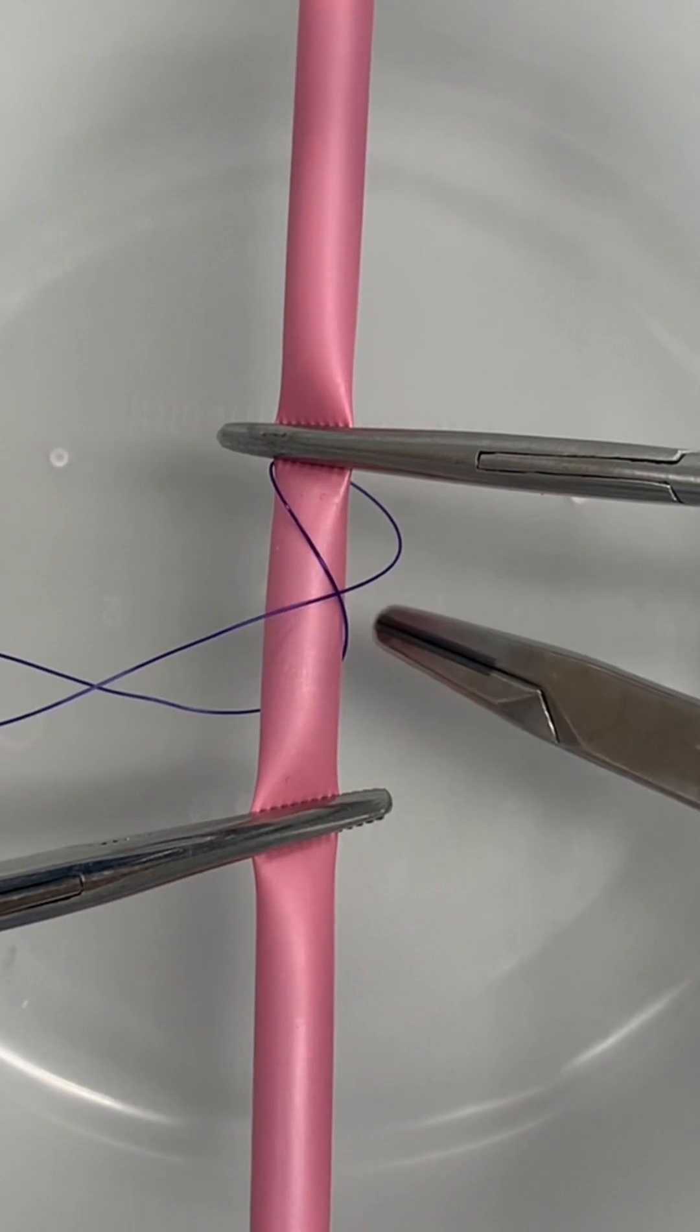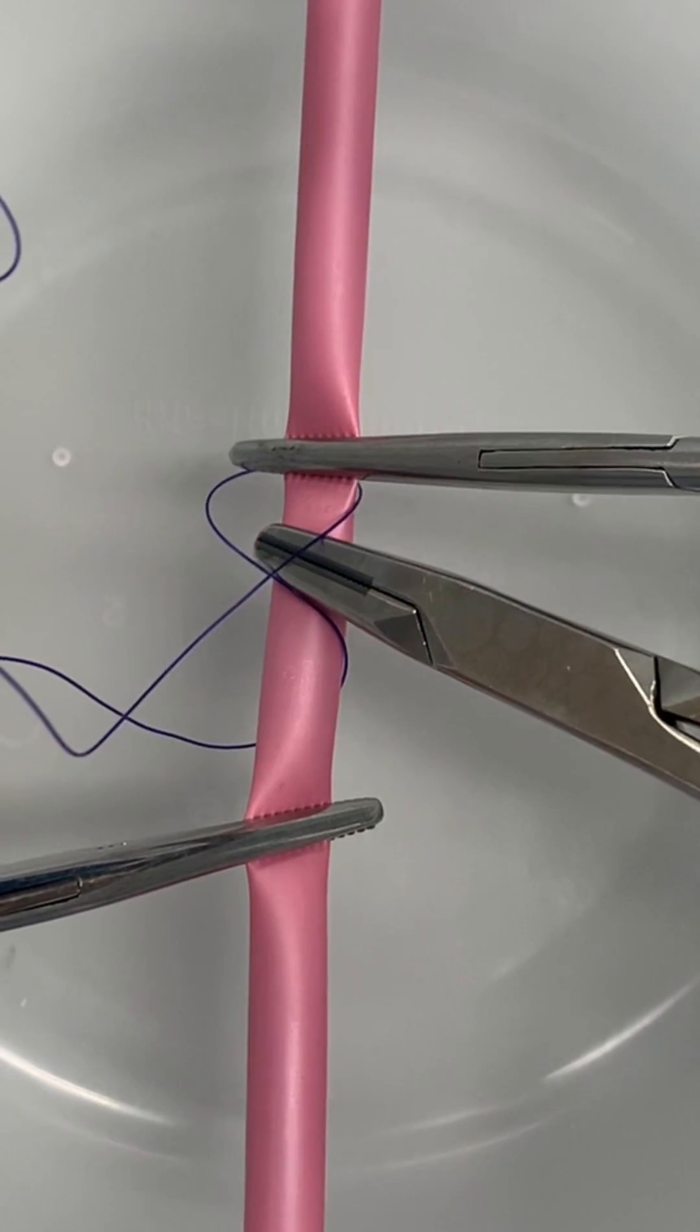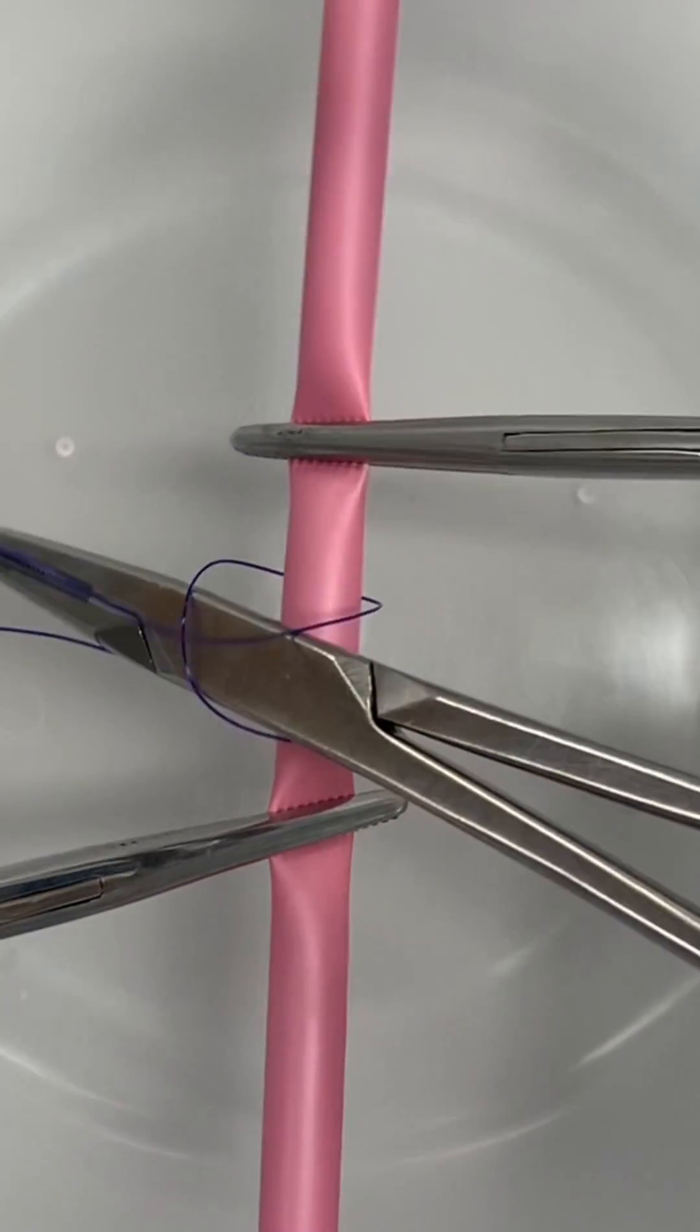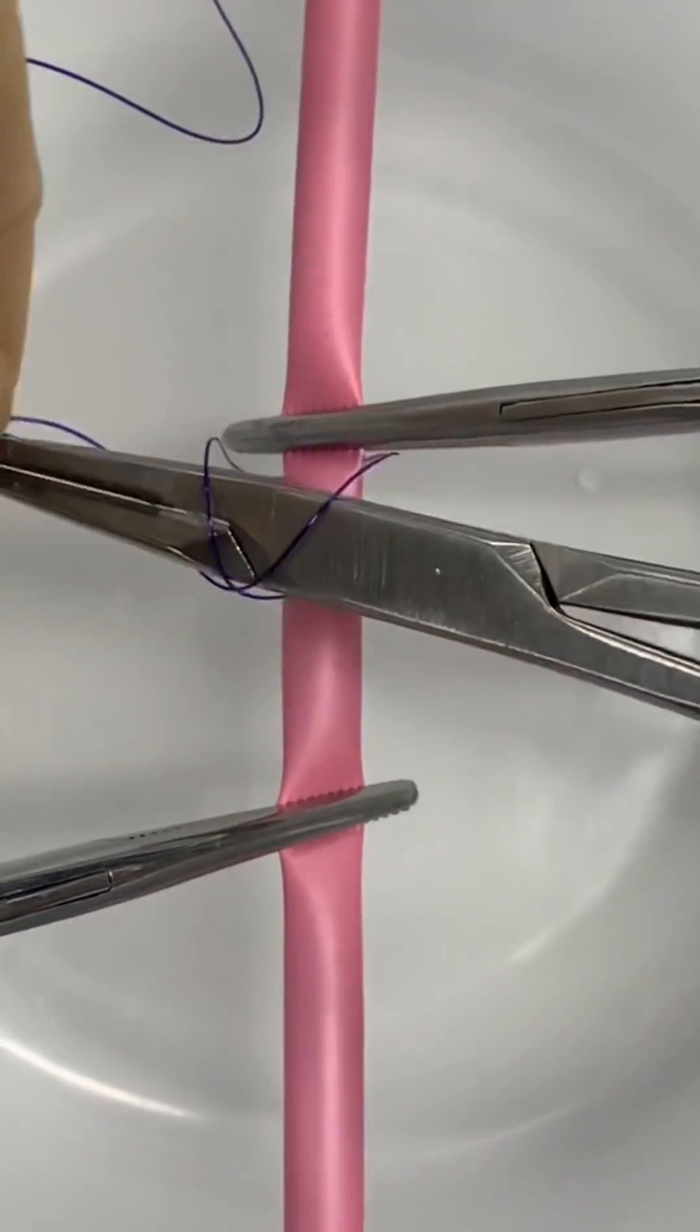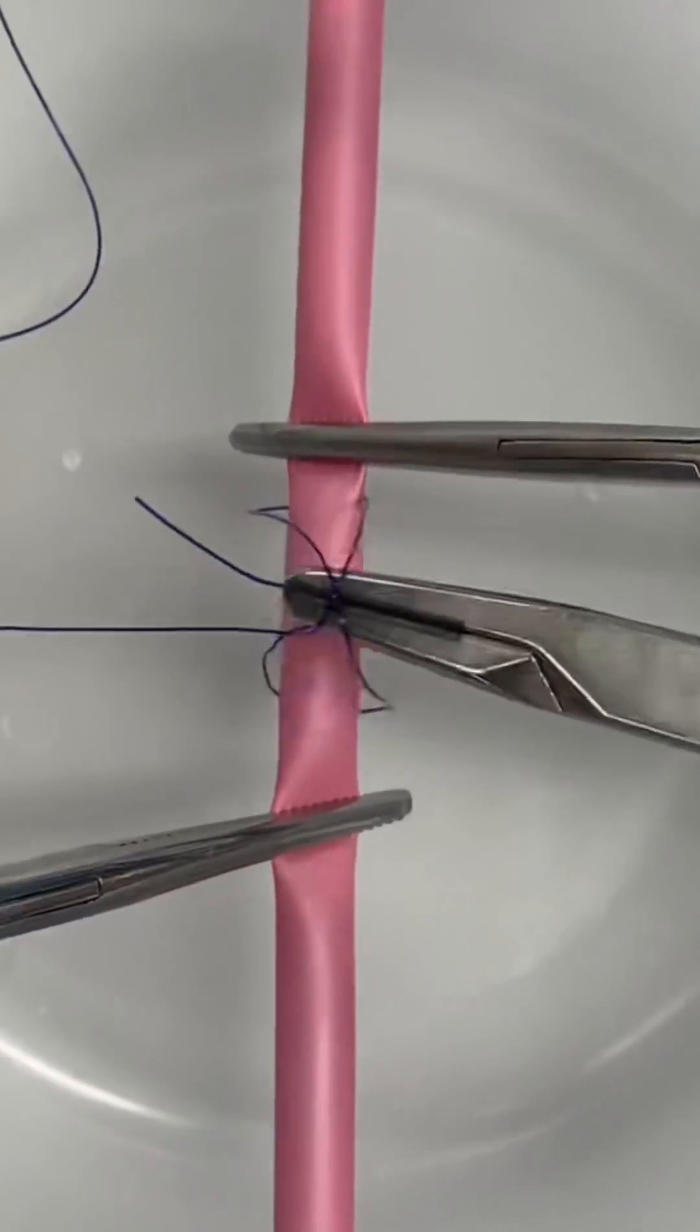Hold onto the ends of suture material in your non-dominant hand and pass the needle holders under the X towards the side of the free ends. Then let it pass over the long end to grab onto the short end and pull it through.